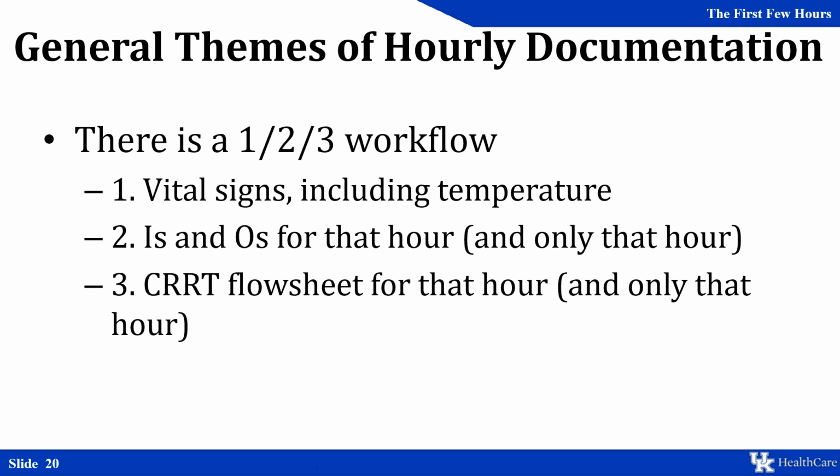The general theme of documentation is a 1-2-3 workflow. 1, we'll do our vital signs, which include temperature. This is a policy at UK Healthcare that any patient on an extracorporeal device must have Q1 hour vitals. Step 2 are the intakes and outputs for that hour, and only that hour. If you start to chart multiple hours at once, it'll confuse the flow sheet. And then of course step 3 is the CRRT flow sheet for that same hour that you just charted I's and O's for.